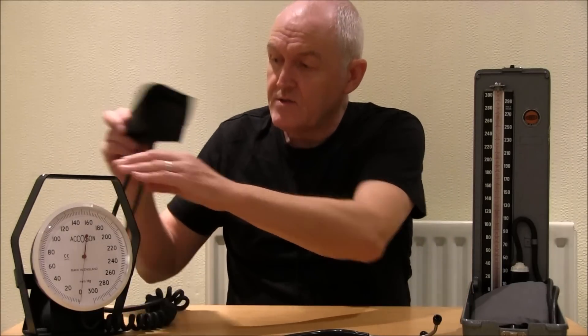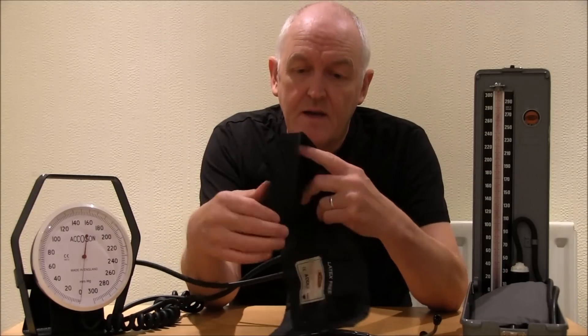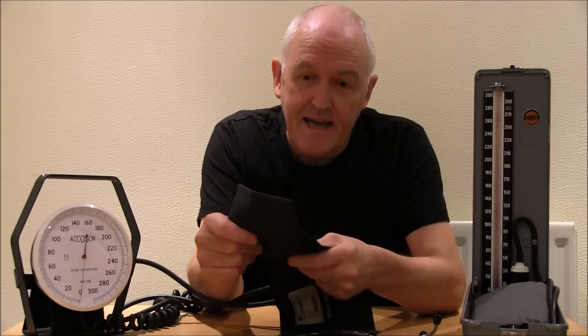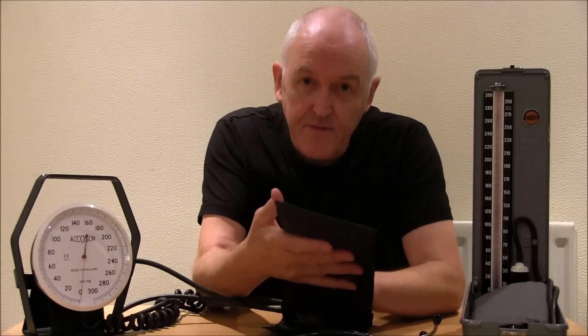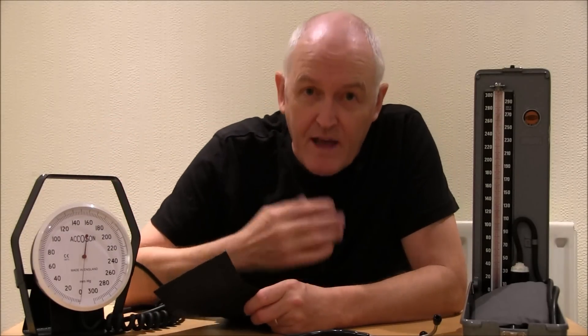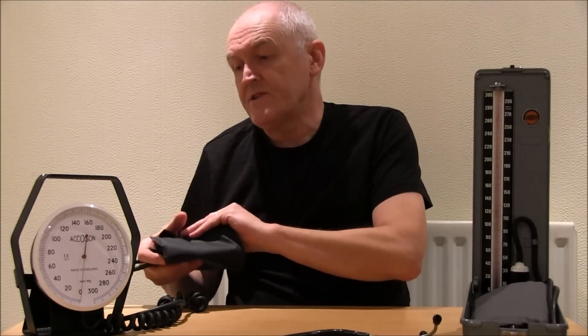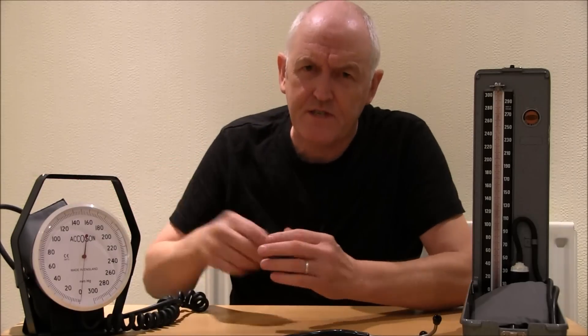What they're both doing is: we wrap this cuff around the patient's arm, and as we blow the cuff up and let it down, the pressure in the cuff is going to be the same as the pressure recorded on that dial — that's how we know it works. What we're listening for are sounds called Korotkoff's sounds, after Nikolai Korotkoff, the well-known Russian surgeon who first published in 1905.